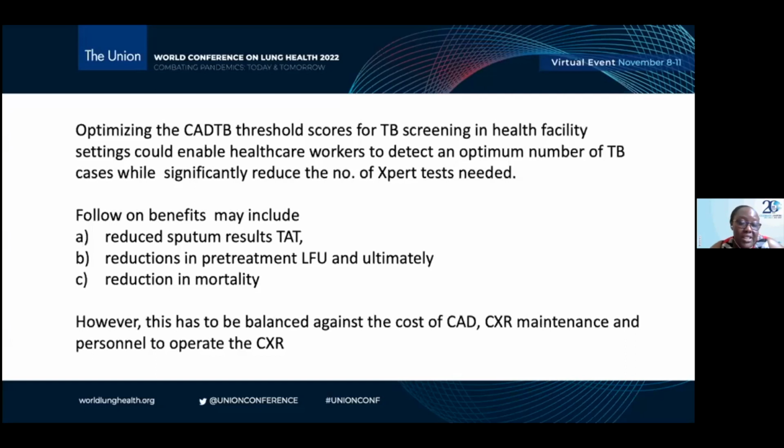We also know from previous studies carried out in Uganda that patients who experience pretreatment loss to follow up have much higher mortality than those who are successfully linked to TB treatment. So if we could optimize the threshold score, then these could be the long-term benefits. However, we have to balance this against the cost of CAD, the cost of X-ray machines, and the cost of personnel to operate these X-rays.